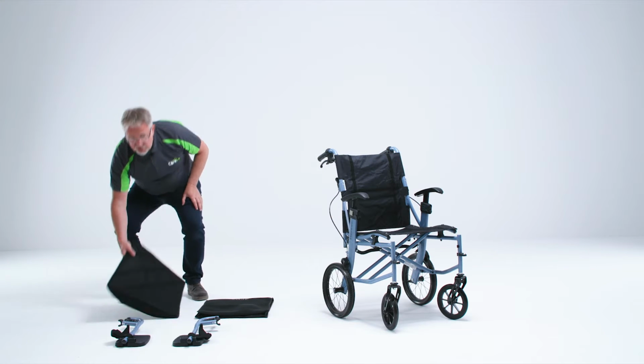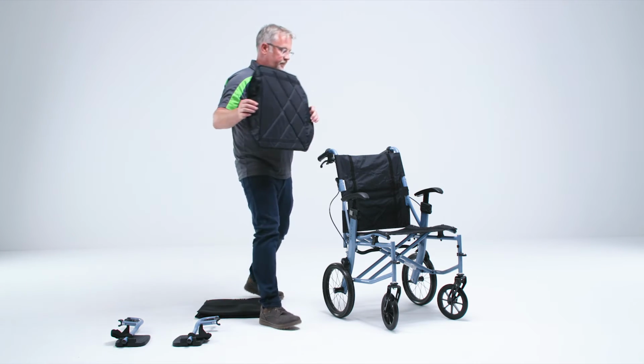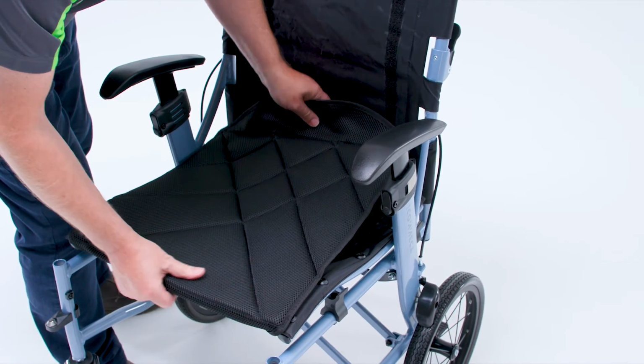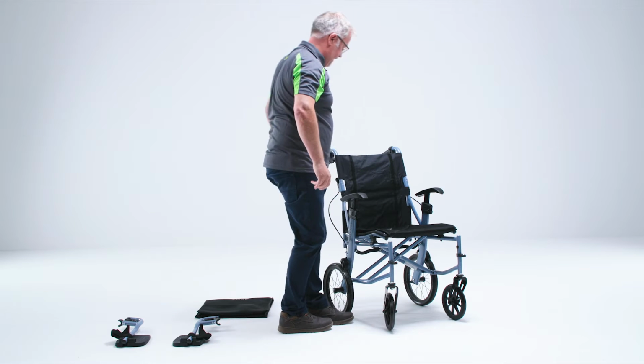Take the seat pad first. This is just held on with Velcro. Place it onto the seat and then roll these parts underneath and they will be retained in position by the Velcro.